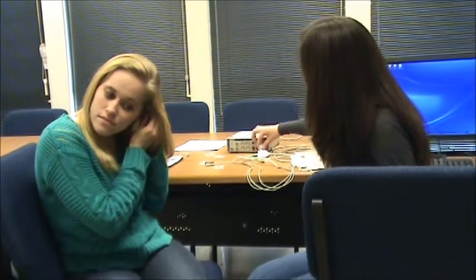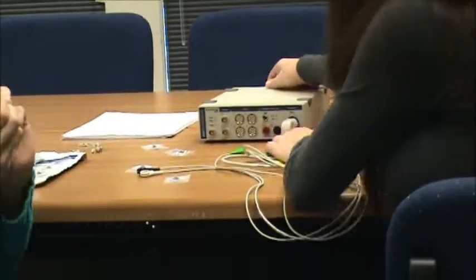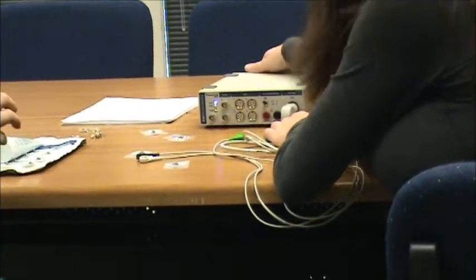Before we begin, please ask your subject to remove their jewelry. Also make sure that there's power to the power lab by first plugging in the leads, which we're going to be putting on the subject, and then flipping on the black switch in the back to turn on power.